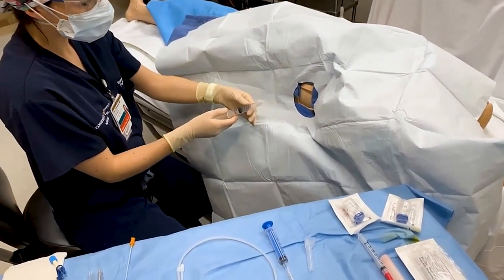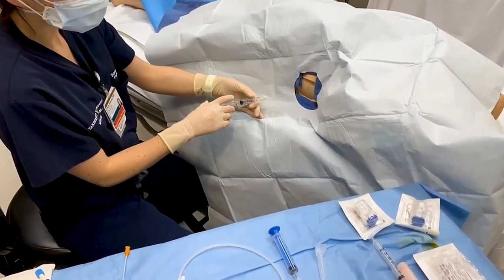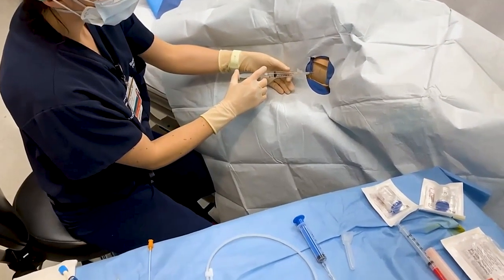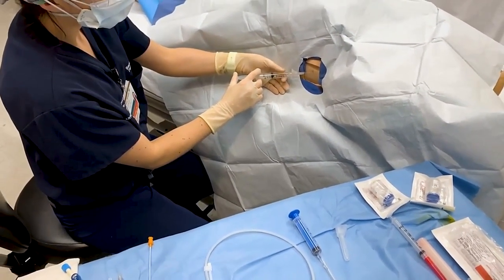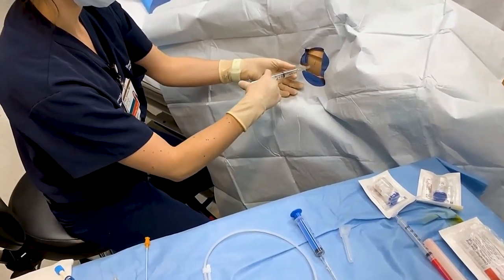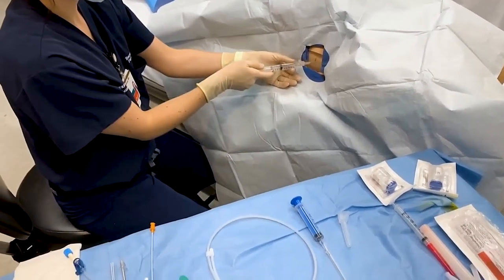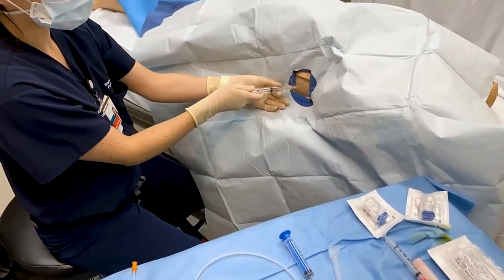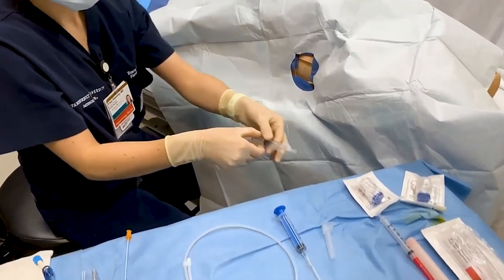We're going to talk through the steps of placing a pigtail catheter chest tube. The first step, after identifying the appropriate location — which is the same as for a chest tube — is injecting lidocaine. We already have the patient cleaned with chloroprep and sterilely draped for this procedure.